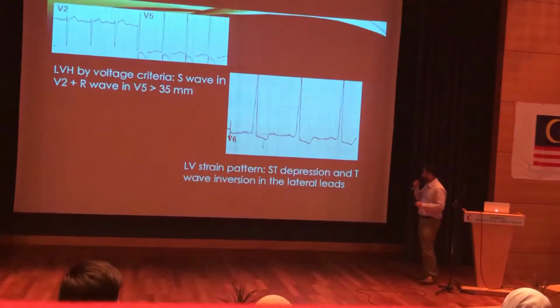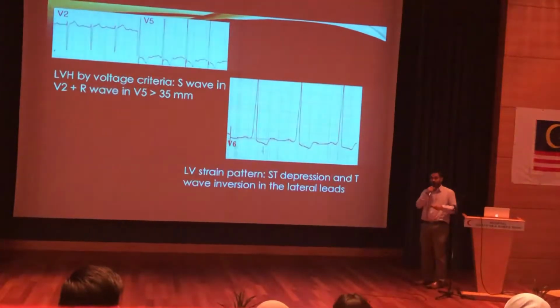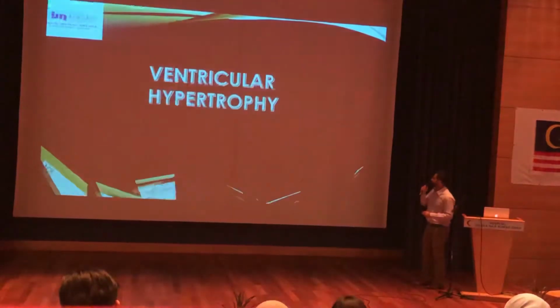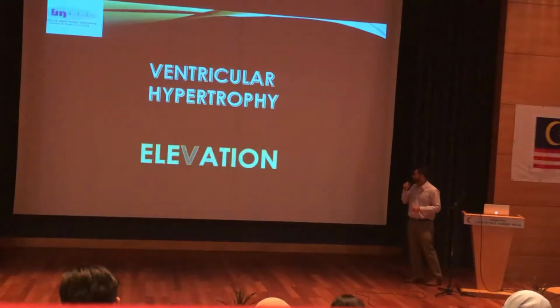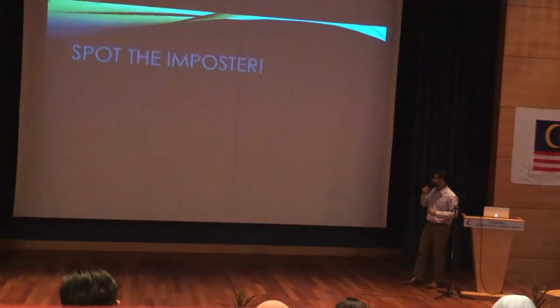Next one. The left ventricular strain pattern that I was speaking about. You all appreciate? Looks better now? You all can differentiate? Great. So, ventricular hypertrophy, the strain pattern with ST changes.